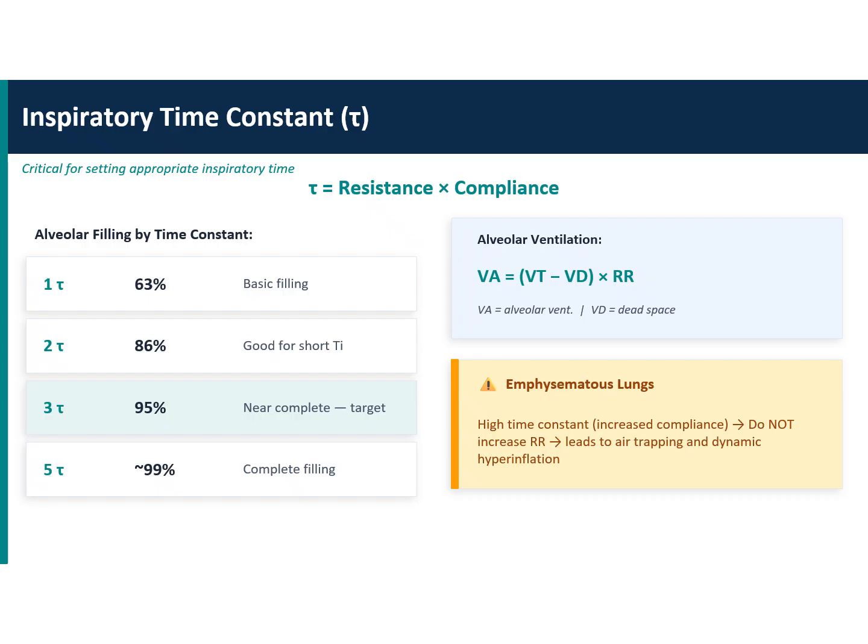So the time required to fill the lungs will be high. In COPD patients, if you increase the respiratory rate too much, you are bringing down the time for inspiration and expiration. Each respiratory cycle you are shortening. So you won't be filling the lungs; rather, you are just filling the dead space in the airway, whatever dead space is available before the alveoli, and coming back. So rapid breathing in COPD will be a problem.